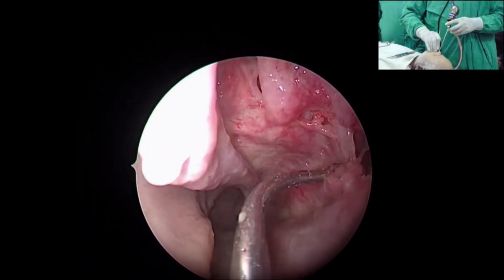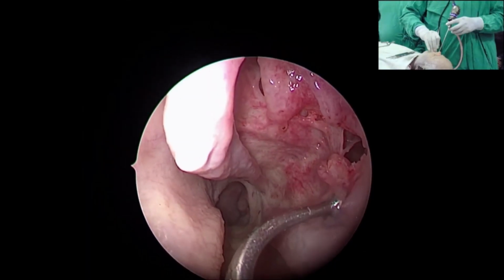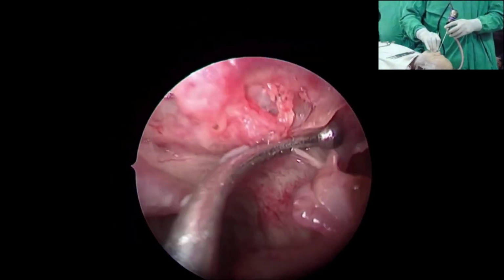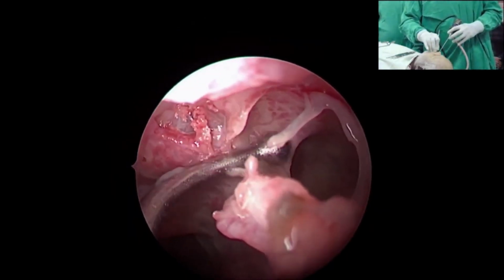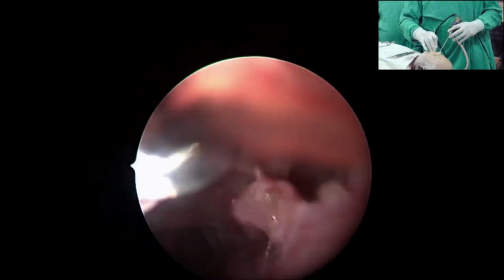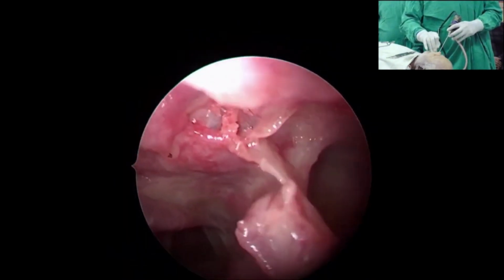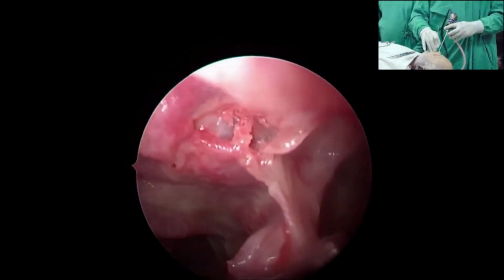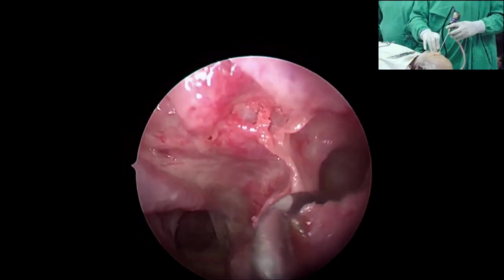See this, what I have opened. Yes. This is the three-dimensional infundibulum, can you see? And into which this is the ostium of the maxillary sinus. Can you see laterally? Yes. This far laterally is the ostium. So whatever defects you may find in the lateral nasal wall looking like ostium are never natural ostiums. Okay? What are those? Like Paramita mentioned just now, those are accessory ostium.